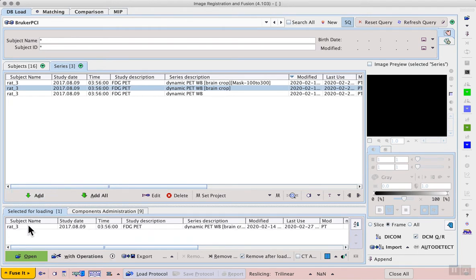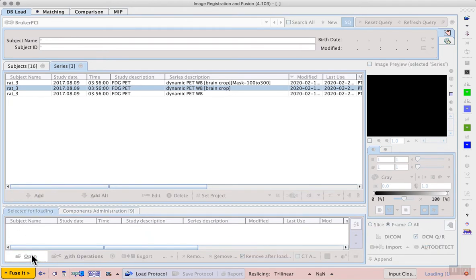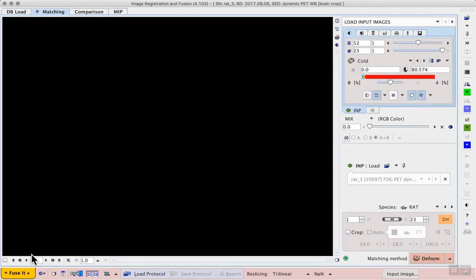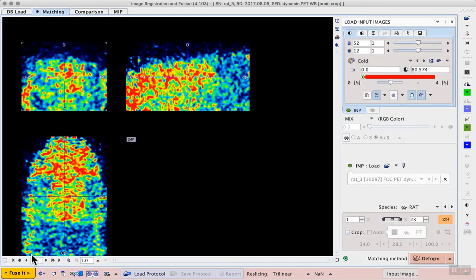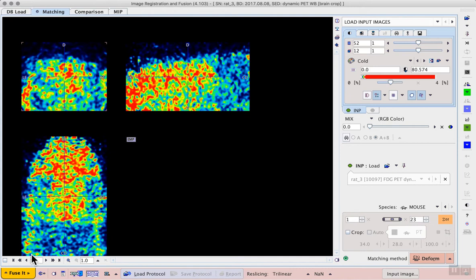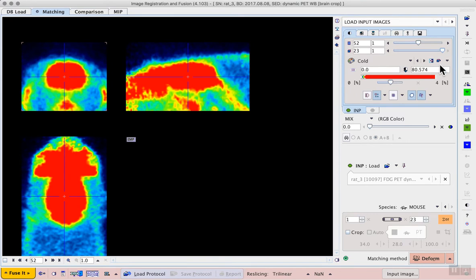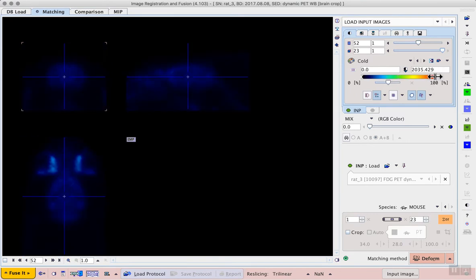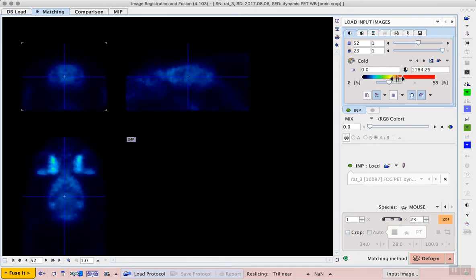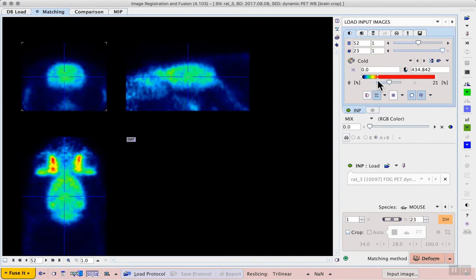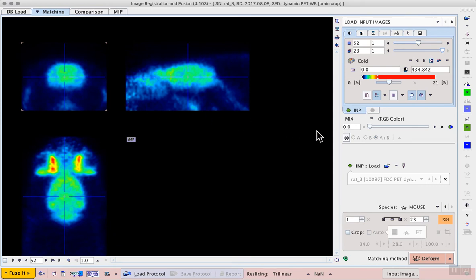When we open this series, it will be selected as the input image in FUSE-IT. Now we see one of the middle frames of this dynamic series where there is still a lot of noise during the tracer uptake period. We can select the last time frame of the dynamic series and adjust the upper threshold so that we see the anatomy more clearly. We have clear uptake in the brain and the Harderian glands and we can generally see the shape of the rat head in our image.